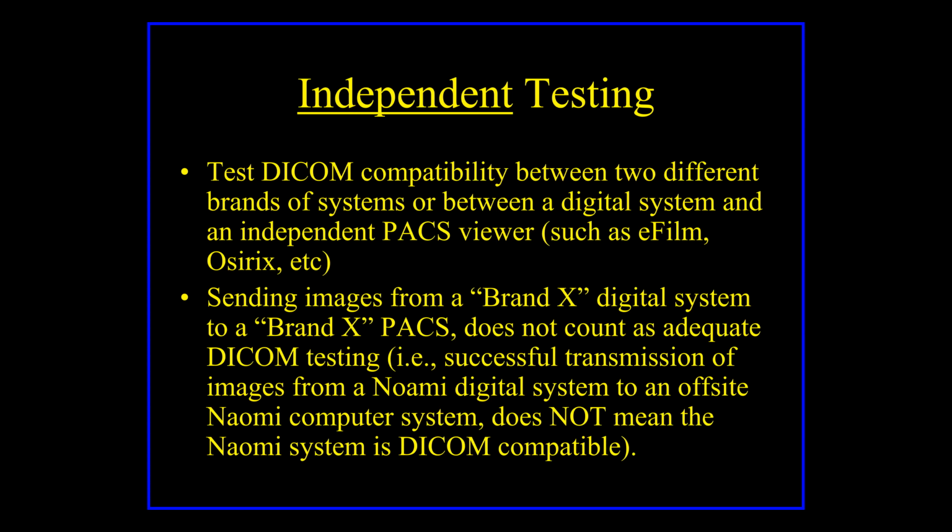and we'll call them and see if they get the images and if it has all the patient information. So I'm going from an IDEX system to an IDEX system. Okay, right there, that should raise a big red flag, because that's not independent testing for DICOM compatibility. What you want to do is go from somebody that has an IDEX system to somebody that has any other brand but IDEX, and make sure they get them. So independent testing to make sure it comes across.